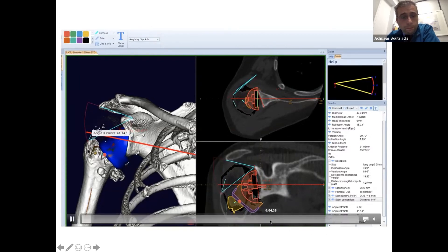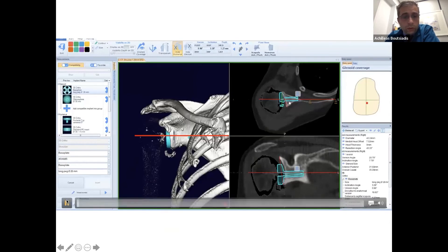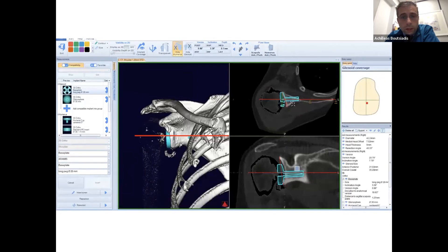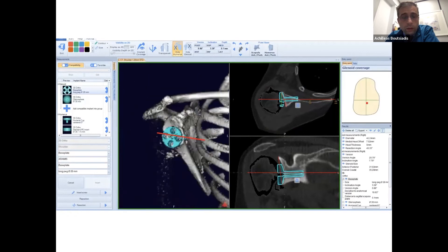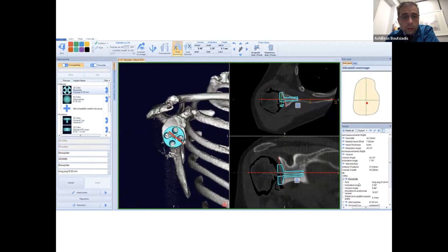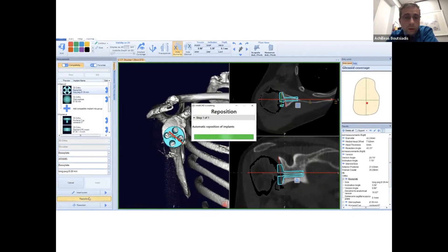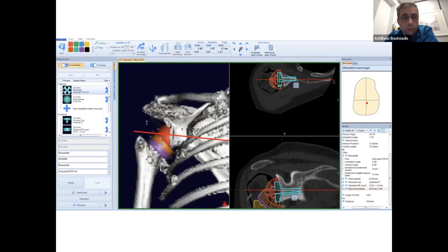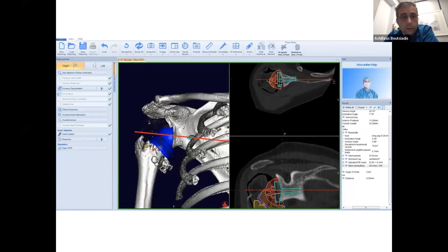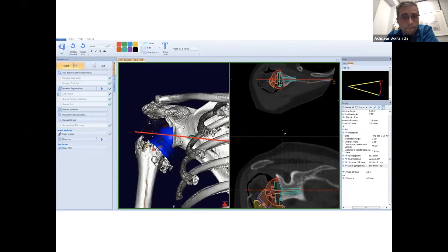We can go back, remove the humerus, remove the glenosphere, remove the stem, and change the position of our base plate — making a little more medialization. Also reducing the bio-RSA offset — probably five millimeters would be better. So we medialize a little bit, replace our implants, reposition our arthroplasty, and measure again. Now our Lateralization Shoulder Angle is about 90 degrees instead of 100 degrees — we are no longer over-lateralizing our prosthesis. Pre-operatively we have our final construct and can see it in 3D, using the tool to remove several slices and see how the implants sit.